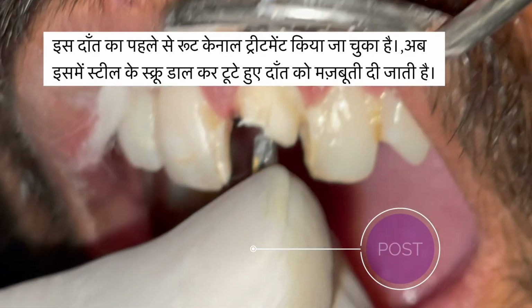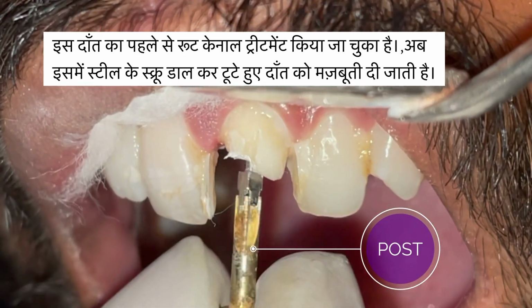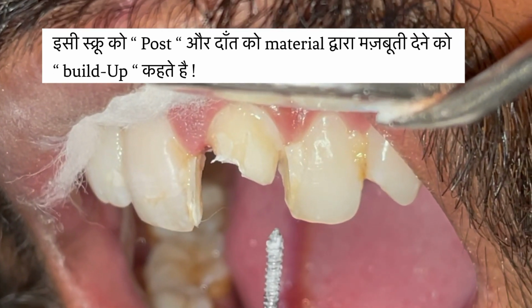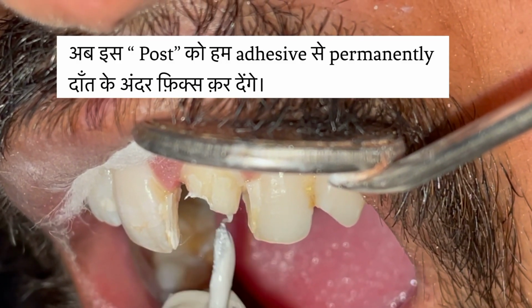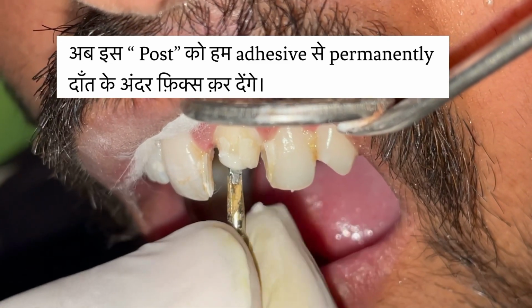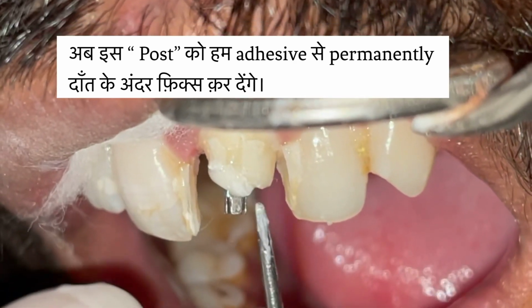This tooth is already root canal treated and there is not adequate strength because of its loss of tooth structure. That's the reason we are going to put a metal screw inside the tooth, called a post, and then build the tooth accordingly by increasing its length, shape and size. A post should be fitted appropriately and tightly inside the tooth. Once we find a suitable post, we fix it permanently with an adhesive material. If the post is not tightly placed, and is loose fitting, it will decrease the durability of the tooth and significantly affect the treatment outcome.